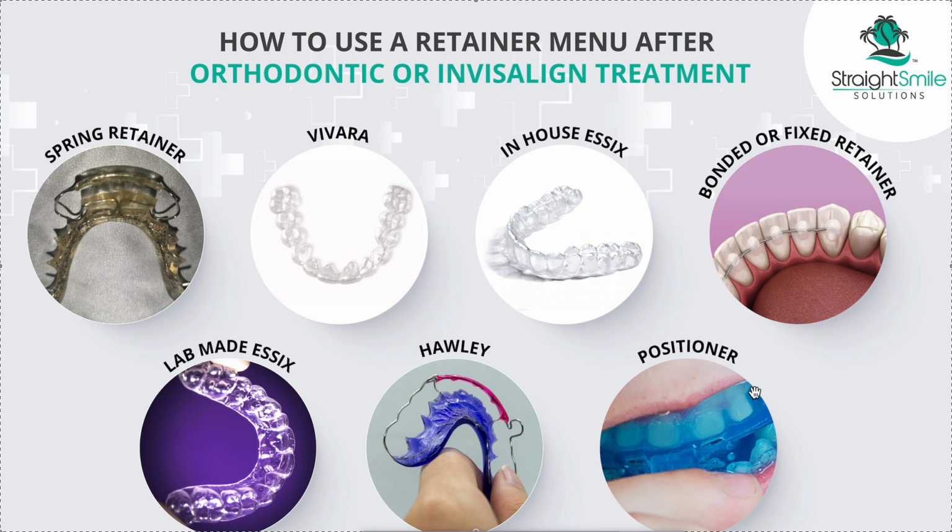And back then you didn't use a retainer for a lifetime. The positioner was used to help settle the bite and to idealize the occlusion. And then they would just occasionally wear it at night, and then they stopped and they all relapsed. It's a BPA-free rubbery plastic material with an elastomeric nature that is custom formed around the teeth.